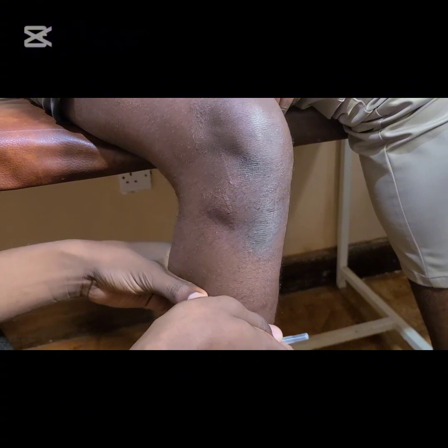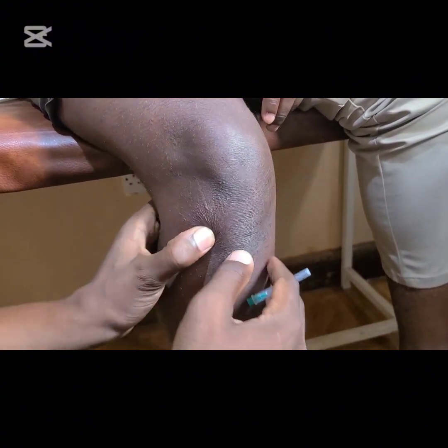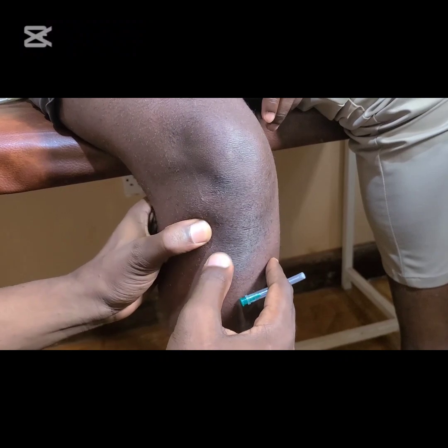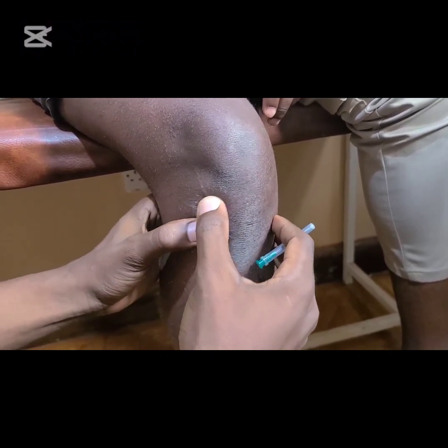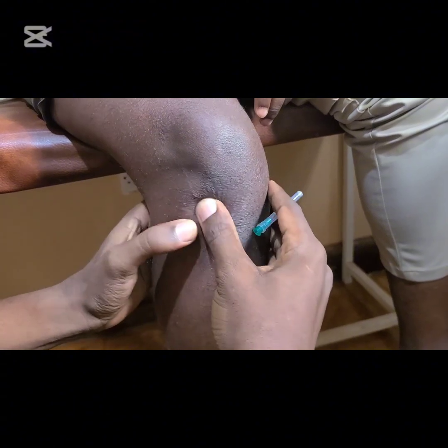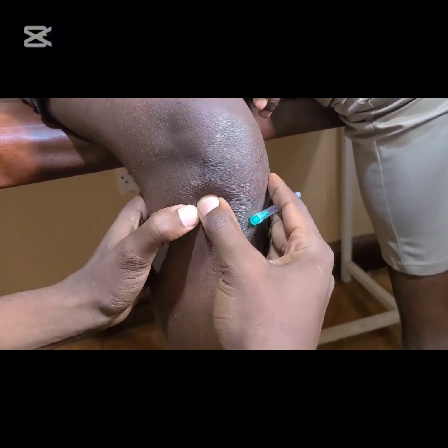So we shall need to make sure that we don't have any excess fluid within our joint, because this is another volume of substance that we're going to add in the knee. So if you already have excess and you're having another volume being added, this is increasing in volume still and increasing in pressure. So this will cause more pain to the patient.